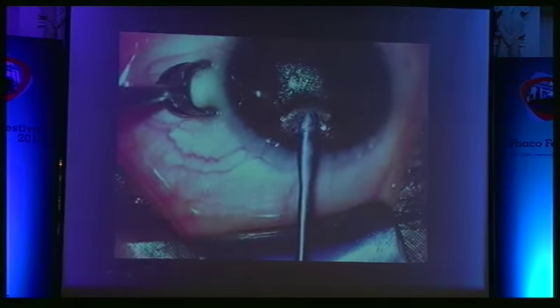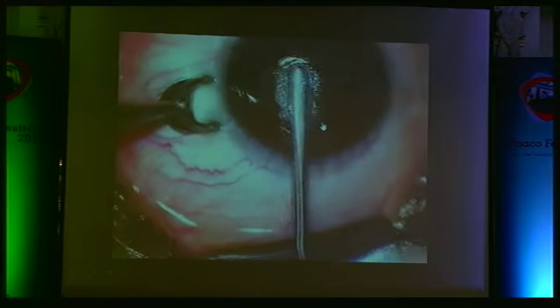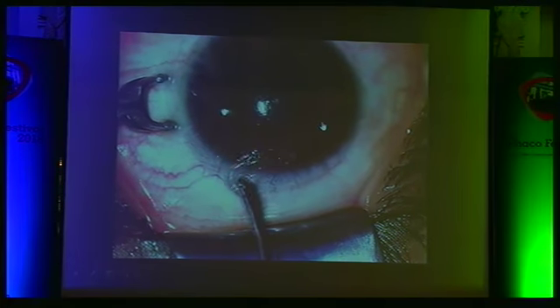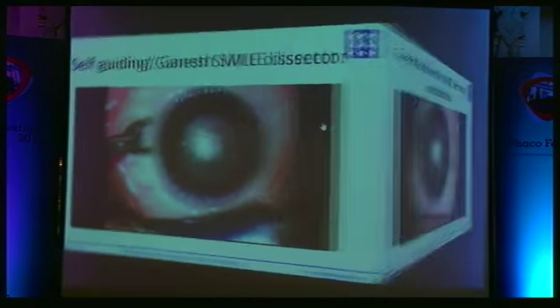and the other side has a more curved shape, and this automatically enters into the deeper plane. So this instrument is useful for beginners in SMILE, because identification is a very critical step in the surgery.